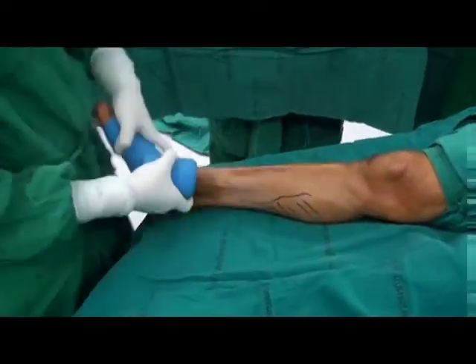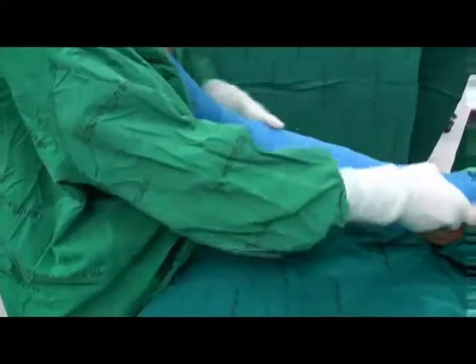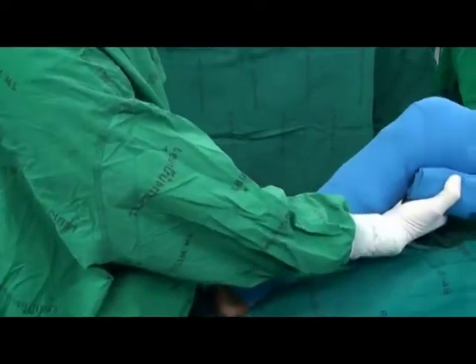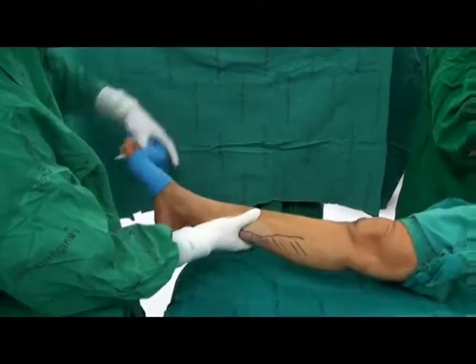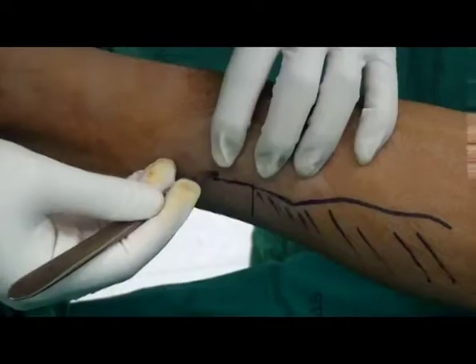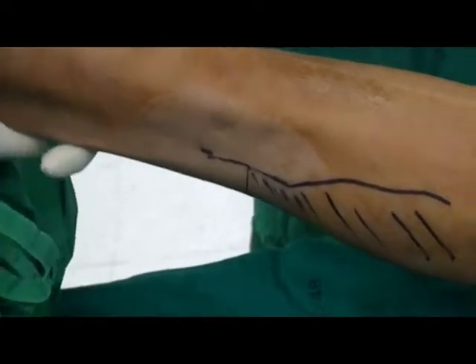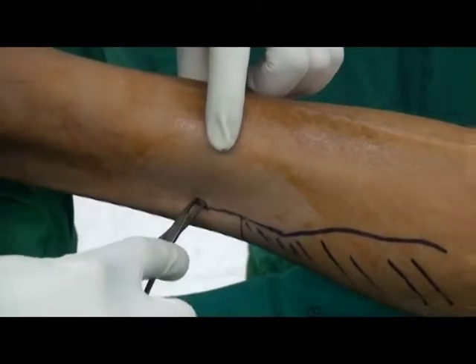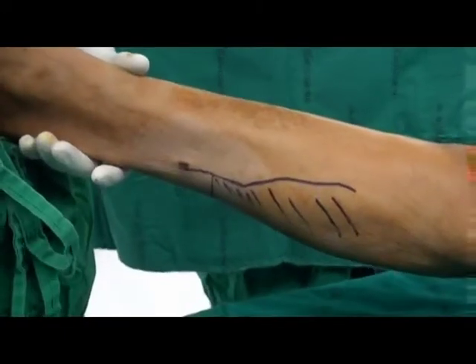The leg is elevated, an Esmarch bandage is applied, and the thigh tourniquet is inflated in order to maximize visualization during the procedure. A number 15 scalpel is used to open the medial portal. Skin and soft tissue is dilated using a hemostat.